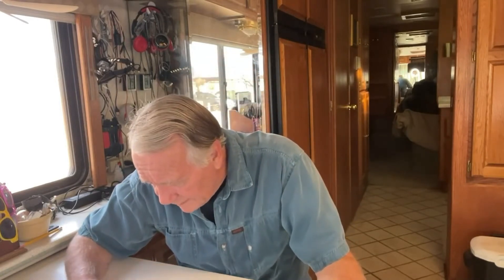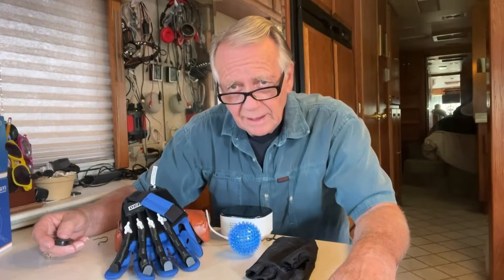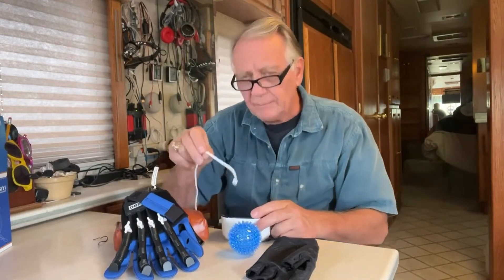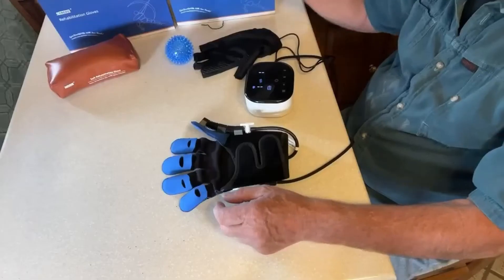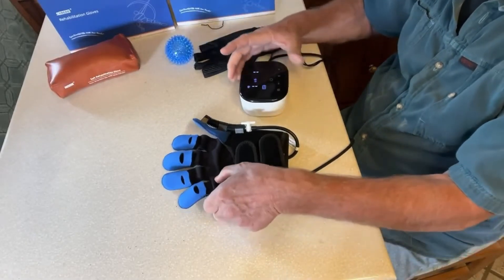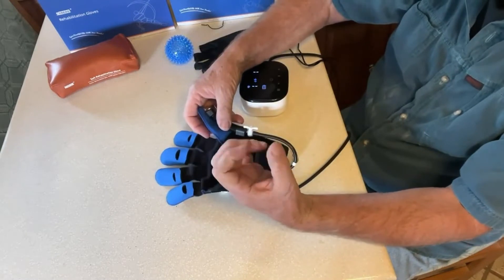I'll get back to you when I figure out how the Cyrebo rehabilitation glove works. Their motto, by the way — I'm reading this off of the box — is 'Gain beautiful life with your hands.' Read the manual; you get it online in PDF format. It's pretty straightforward. The power cord is only used to charge the internal battery — you don't actually have to have it hooked up to power when you're using it. There are two modes set by the host: the first is passive training.